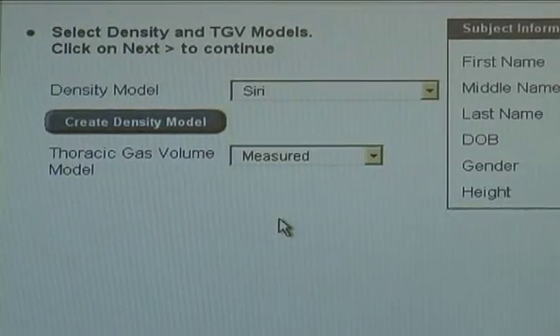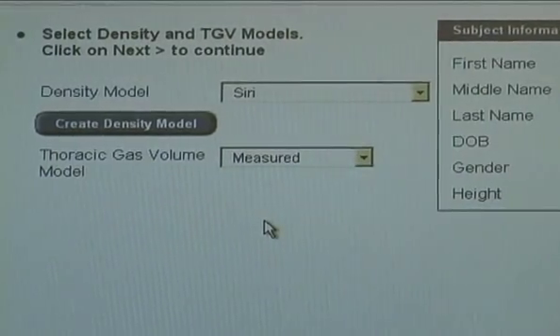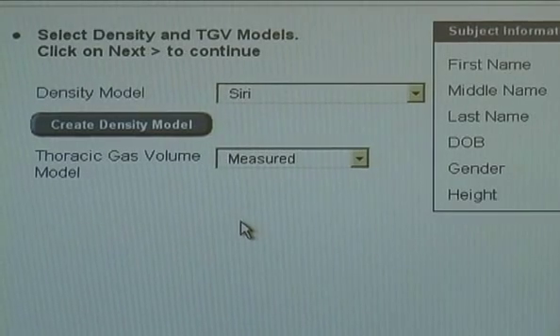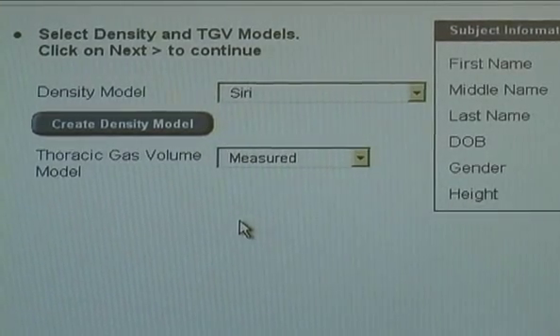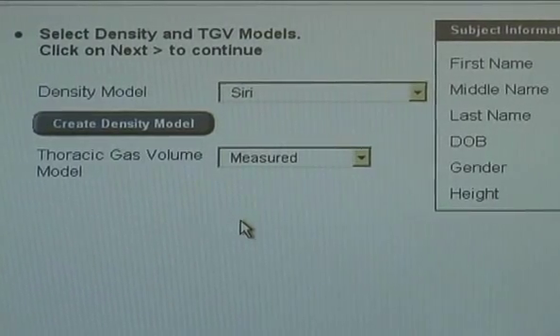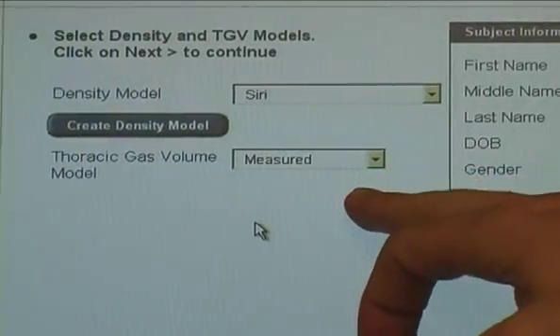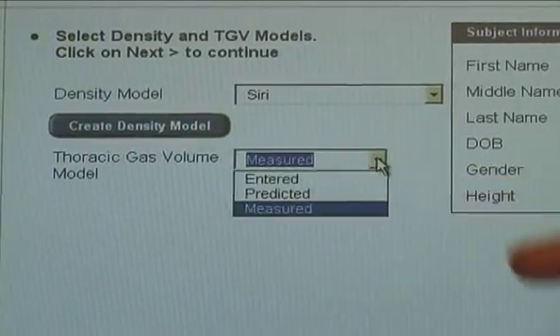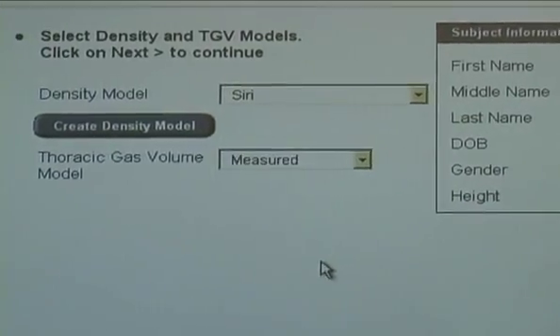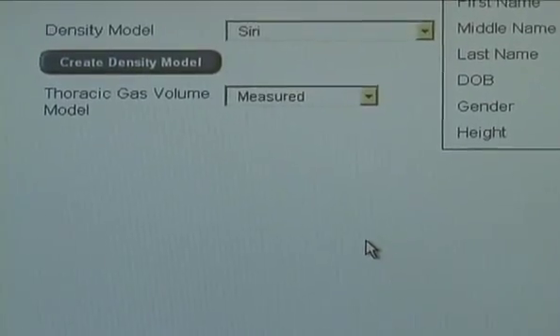When you're sitting in the BOD pod, you're sitting there breathing normally. You'll see when Brittany gets in there. And we want the amount of air that's in your lungs when you're sitting and breathing normally. You're not having to expel out all your air. So our gas volume is thoracic gas volume. It's the amount of air that's in your lungs while you're sitting there. So we can do measured or predicted. We'll do measured. And entered is a selection if somebody came from another school, they know their lung volume.